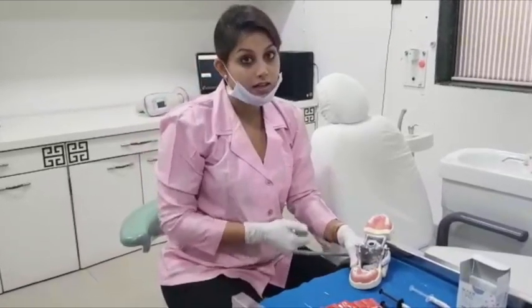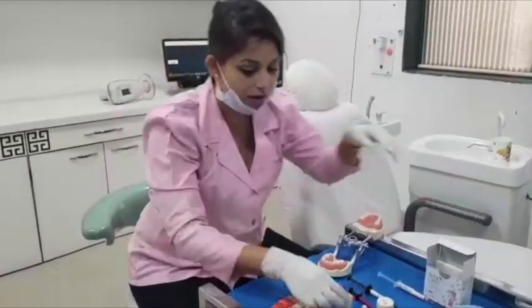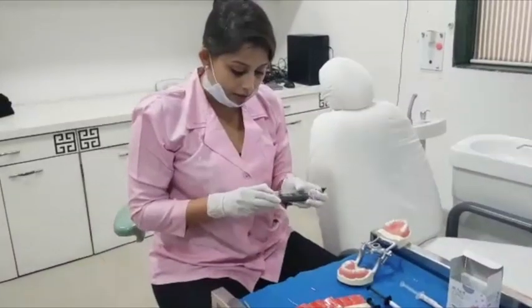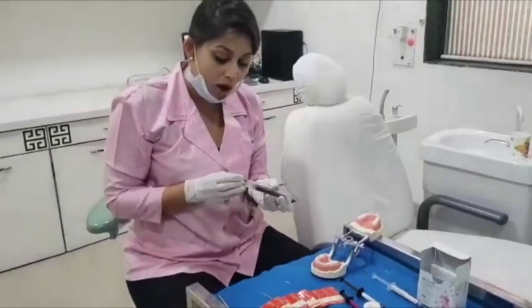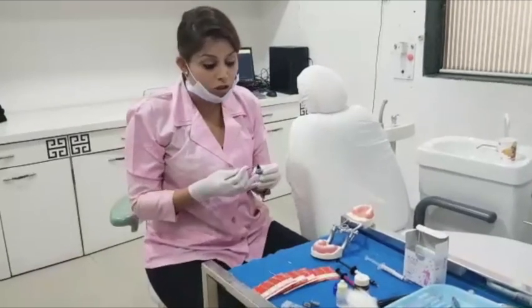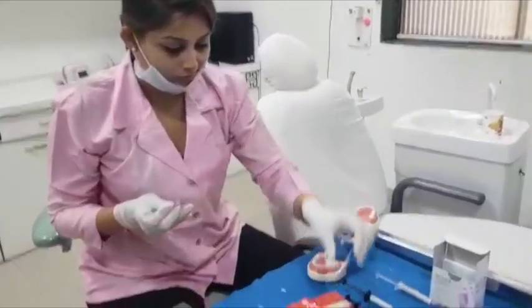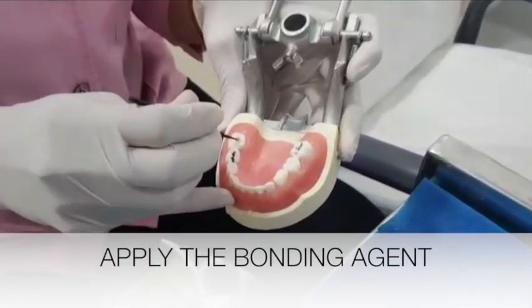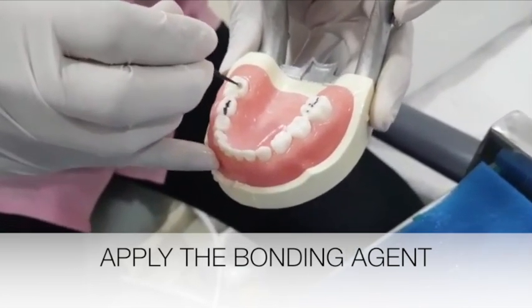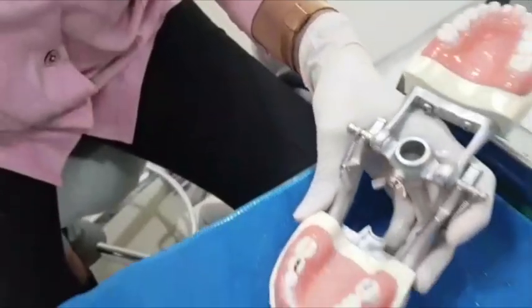Now I take my bonding agent. There is a very learned researcher called Crowe who has published a lot of data on why you need to use a bonding agent — because it aids in the retention of the sealant and aids in its longevity. So I am going to take my bonding agent and apply it to all the grooves and pits that underwent fissurotomy, then cure it — just the way you do it for your composite.